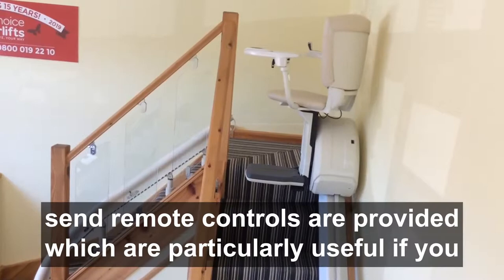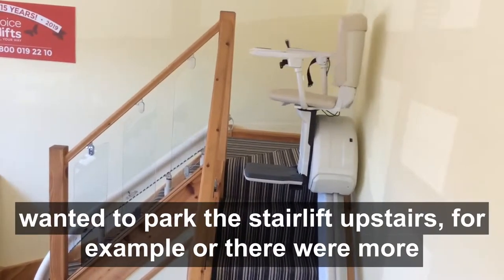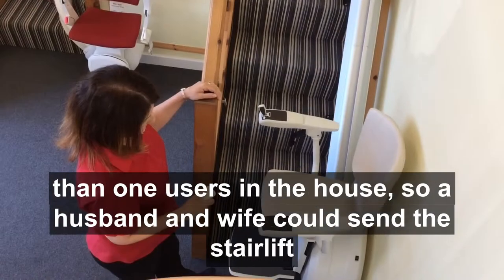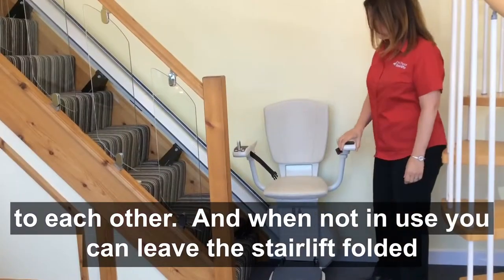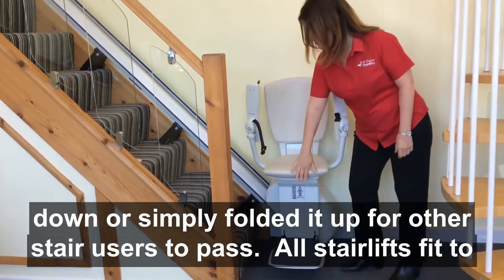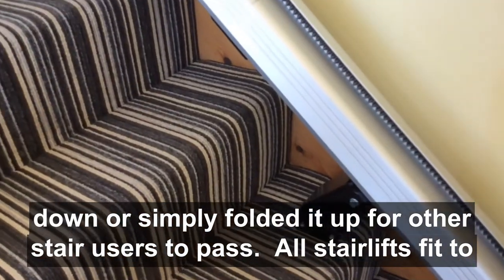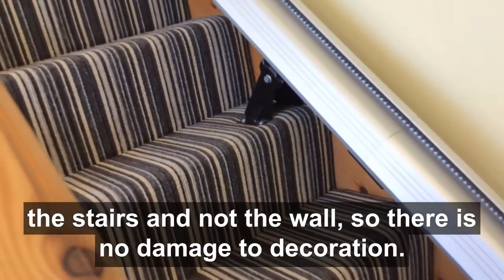Call and send remote controls are provided, which are particularly useful if you wanted to park the stairlift upstairs, or if there were more than one user in the house — for example, a husband and wife could send the stairlift to each other. When not in use, you can leave the stairlift folded down or simply fold it up for other stair users to pass. All stairlifts fit to the stairs and not the wall, so there is no damage to decoration.